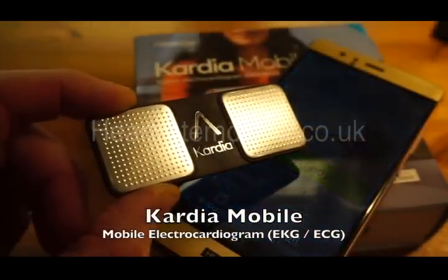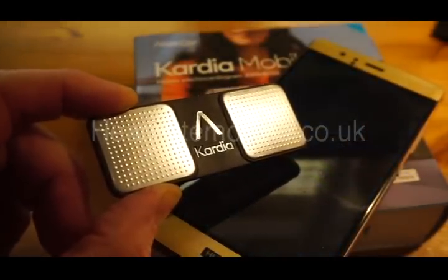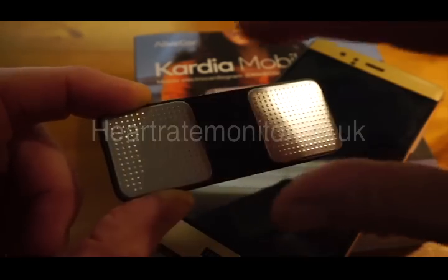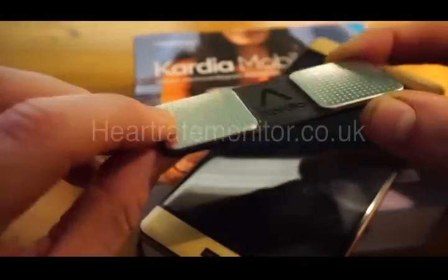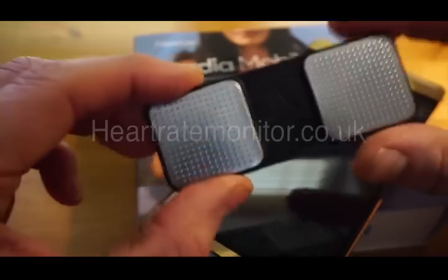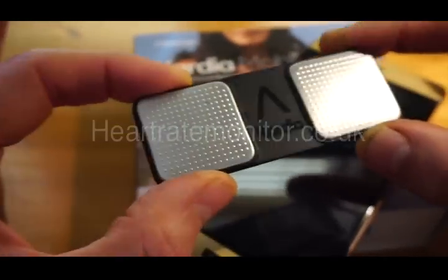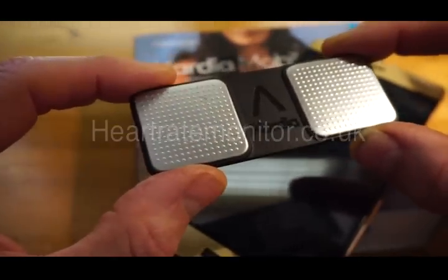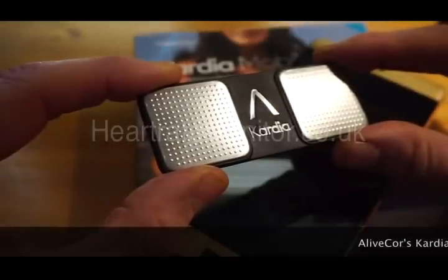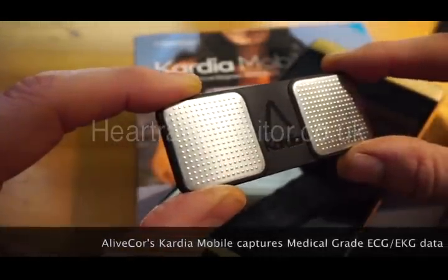Hi, this is Tristan from heartratemonitor.co.uk and this is a very short video review of the Kardia Mobile. The Kardia Mobile is this innovative slimline product here which is, believe it or not, an ECG — or in America, an EKG — sensor.